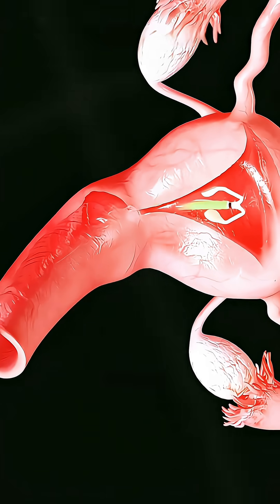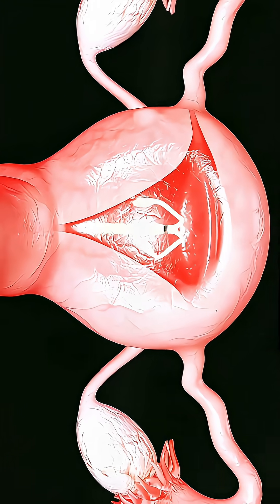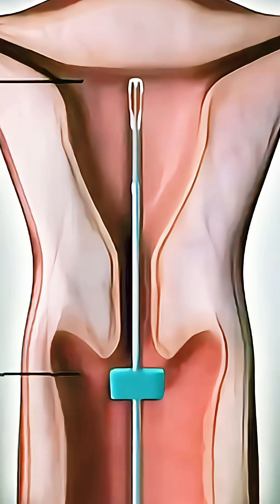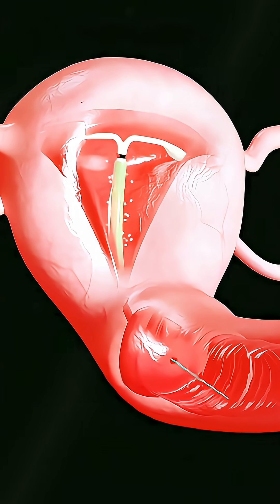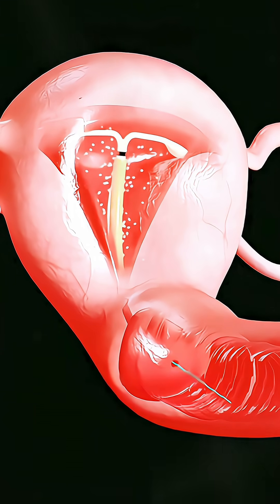Even though it sounds like a lot of steps, the procedure is actually very quick — just a few minutes — and it's almost painless with minimal traces left behind. Once the IUD is in place, it starts providing reliable protection.